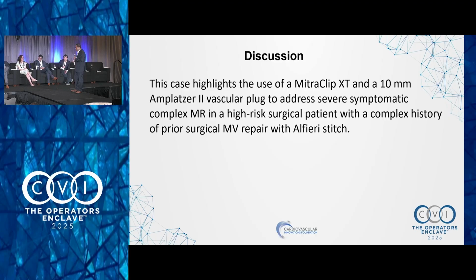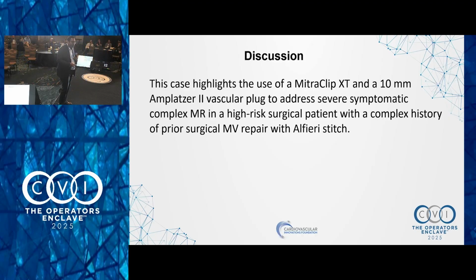I think NTW would have been more like this time right now. At that time, it was NT and XT. I think NT would have been too small, so it's more like a functional MR as well in the center. Did you have a gradient afterwards? 6. From a gradient standpoint, this approach actually may be better, right? Because if you put a clip and you have a higher gradient, like gradient is 5, then what do I do? Although most of the time with the plugs I've done with clips, gradient doesn't change, but here at least you knew that gradient is fine.